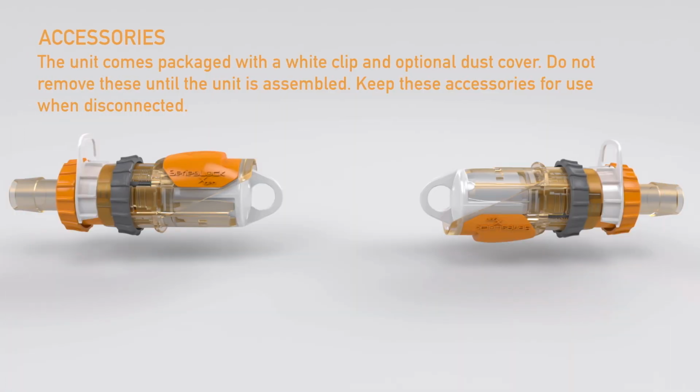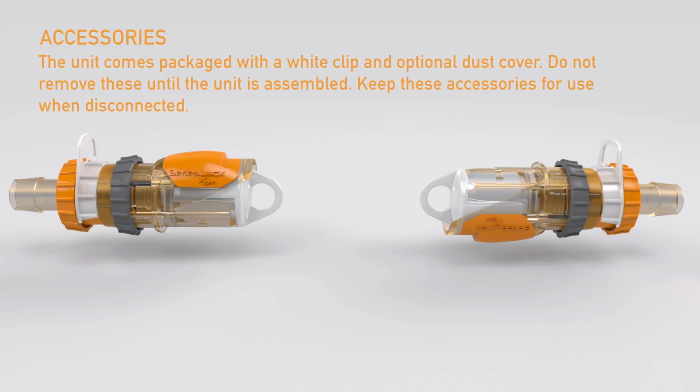The unit comes packaged with a white clip and optional dust cover. Do not remove these until the unit is assembled. Keep these accessories for use when disconnected.